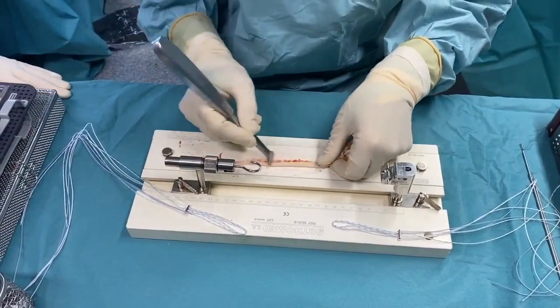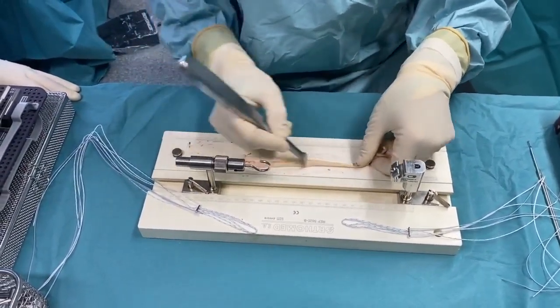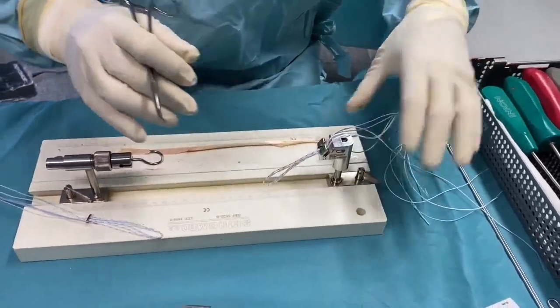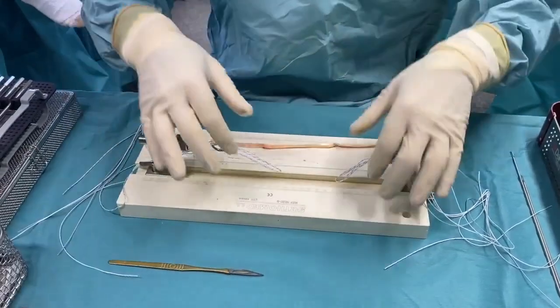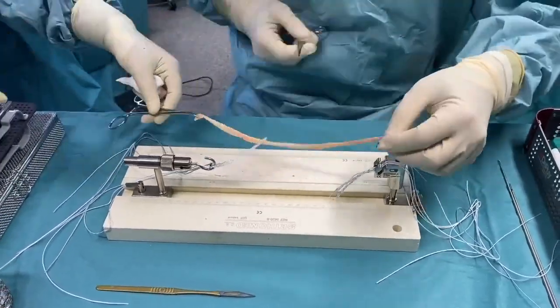Once the semitendinosus is harvested, any residual muscle adhesions are removed. Both endo buttons are placed on the table, then usually the tendon is passed from one loop to the other until a four-strand graft is created between the two clamps.